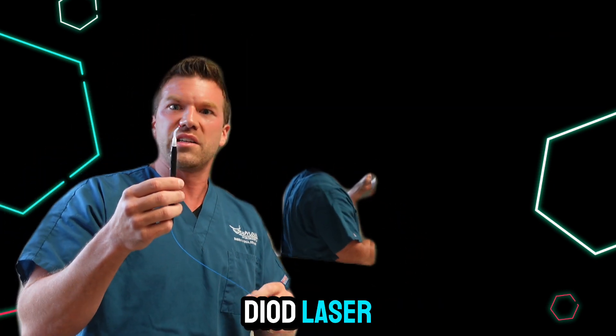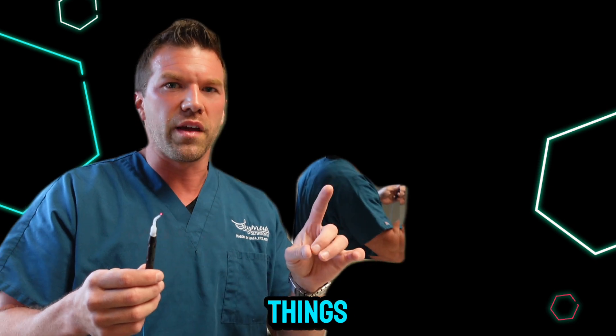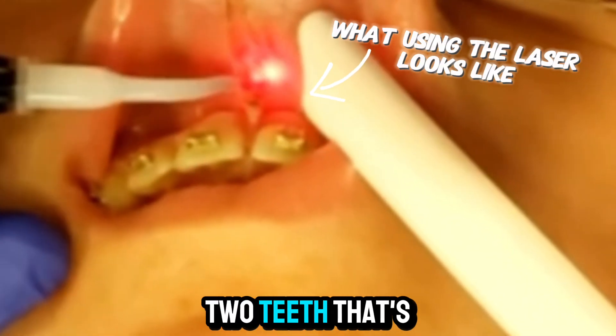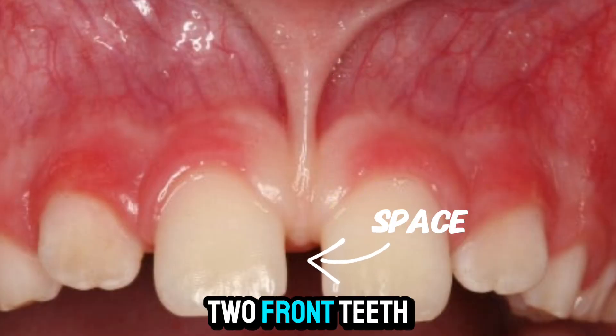This is a soft tissue diode laser. We use these in dentistry for a lot of things. Sometimes you'll have one of those pieces of skin right up there above your top two teeth that's too big, too thick — it can create a space between your two front teeth.